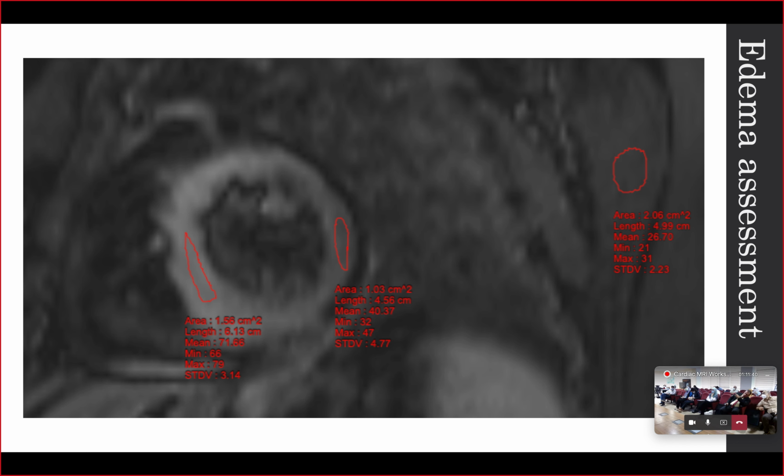For example, in this case, in the affected territory, which is the LAD, the edema is 72 average signal, and the unaffected LCX territory is 40 plus 2 standard deviations, which is 10, so it's 50. So this reflects that this is going to be included by the software when you are measuring the area at risk or the edema area.